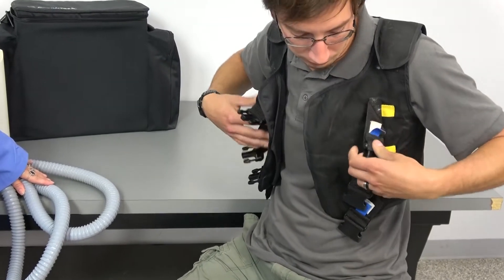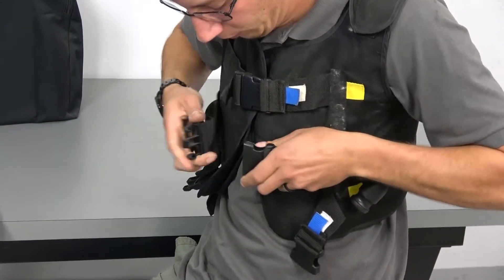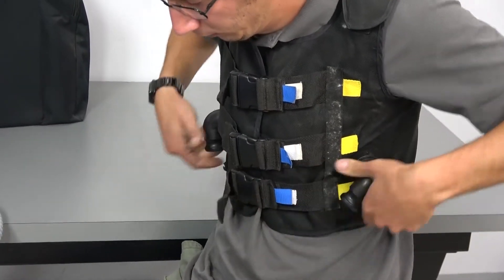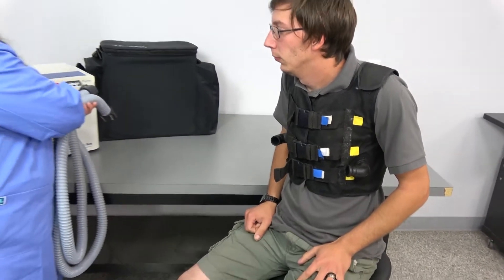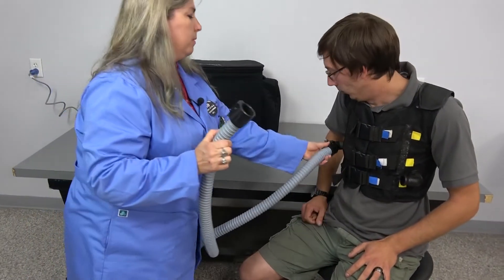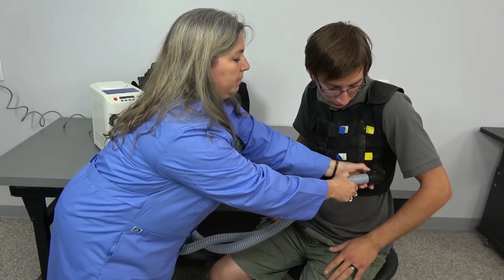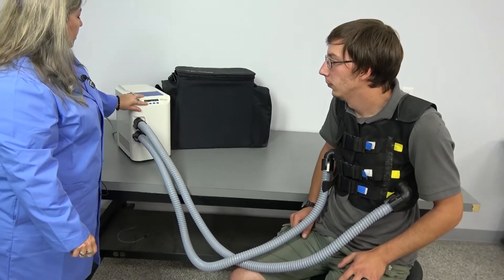It is machine washable. As you can see it snaps on easily. These hoses attach very simply — tighten the clamps — and then we'll start a quick start.